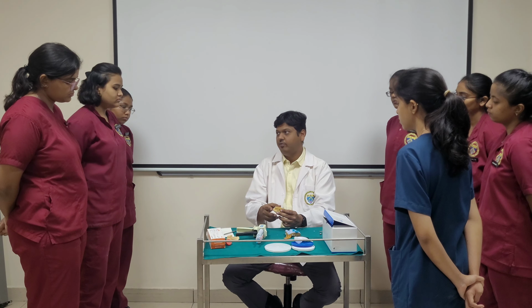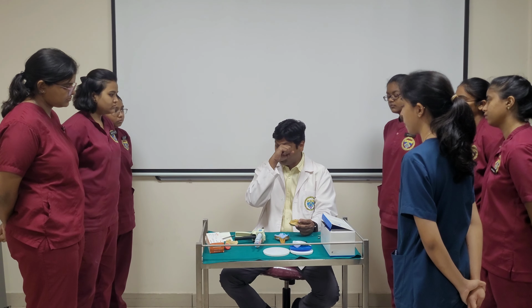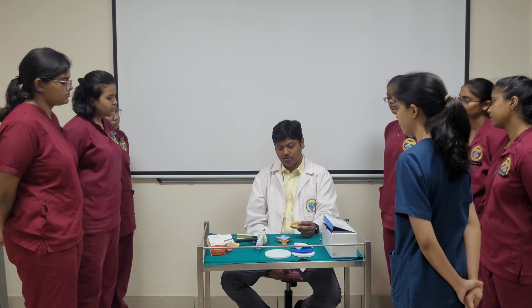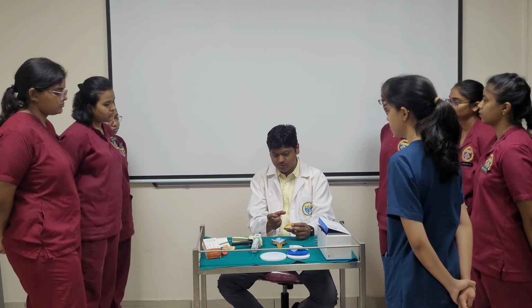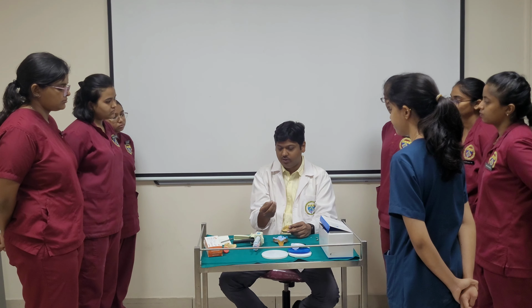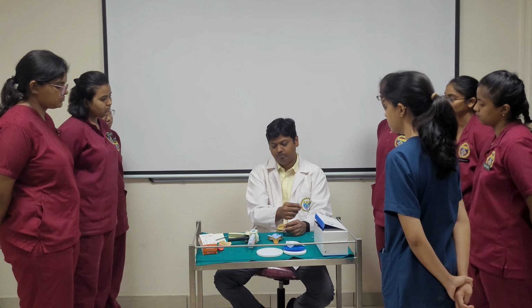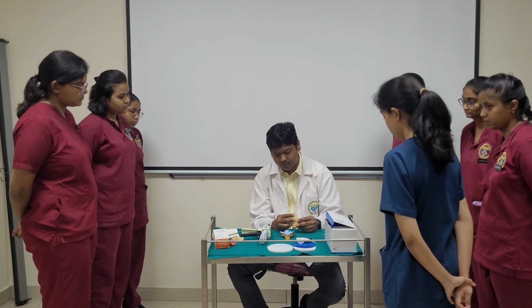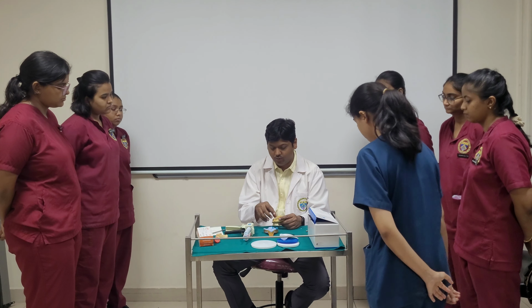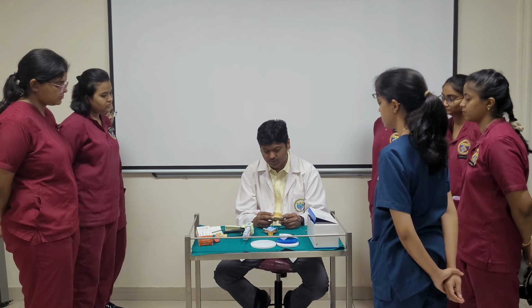Now the model is ready for crown fabrication. It is the same positive replica of the patient's oral cavity. Wherever the implant dimension and implant position were, the mesiodistal and buccolingual, the same thing is transferred with the impression post, and the lab analog mimics the implant. So now you need to place the abutment over it and fabricate a crown. This is about closed tray implant impression.